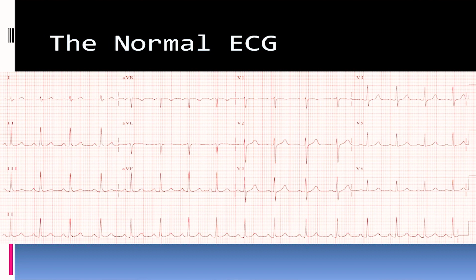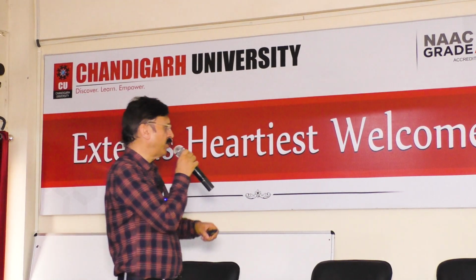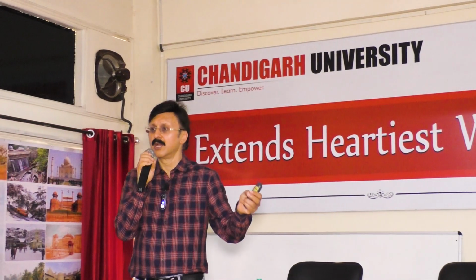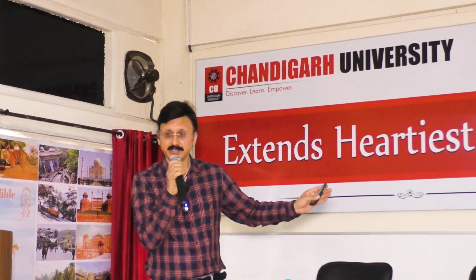Before we start with the ECG, first we have to calibrate the ECG. Do you know how to calibrate? We have to record the patient's name, age, why the patient came for ECG, all the things, and the date on which you have done the ECG.